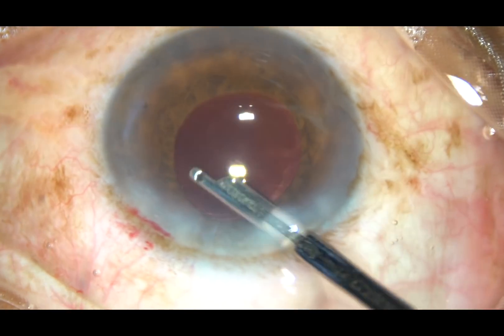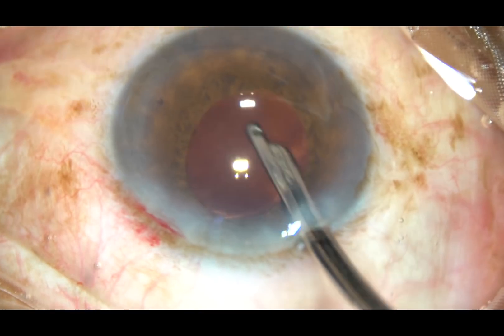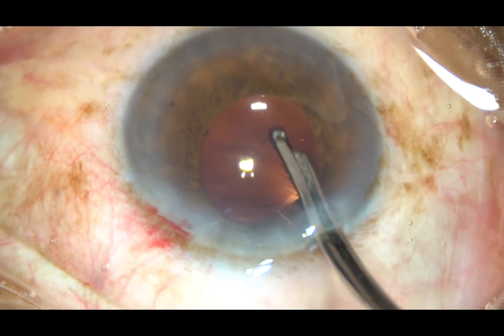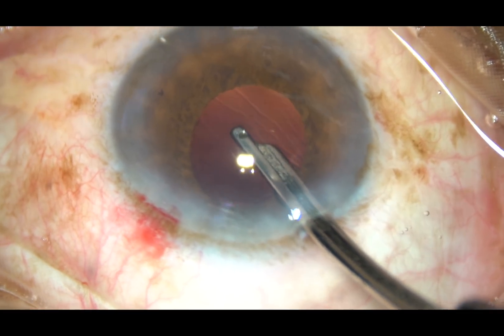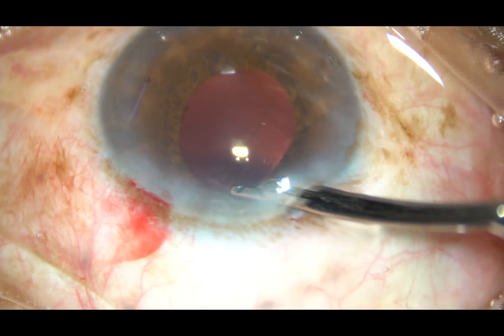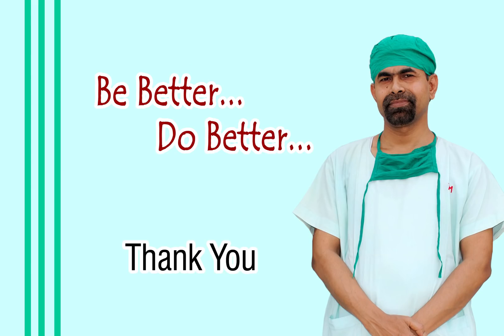Now, here it is — this is the final lavage of the anterior chamber. The side port has been hydrated and it has been closed. The anterior chamber is formed and the case is concluded. Thank you very much for watching. Hope this video will help you in developing your surgical skills and in the management of cases with IFIS.